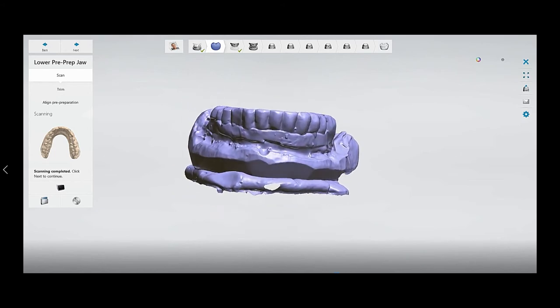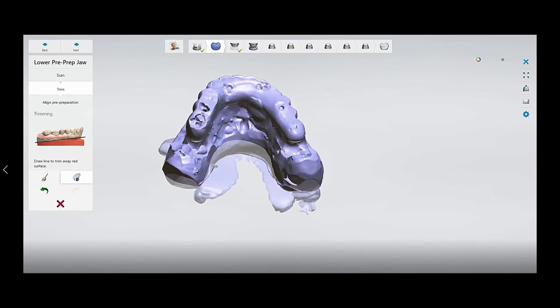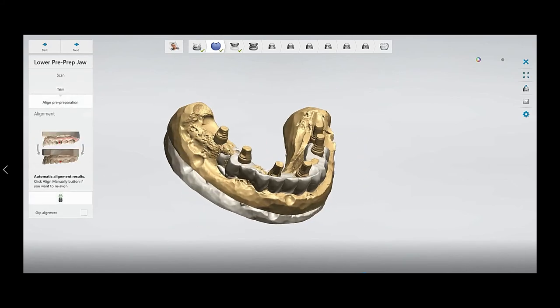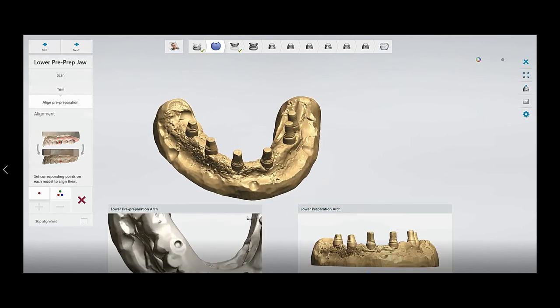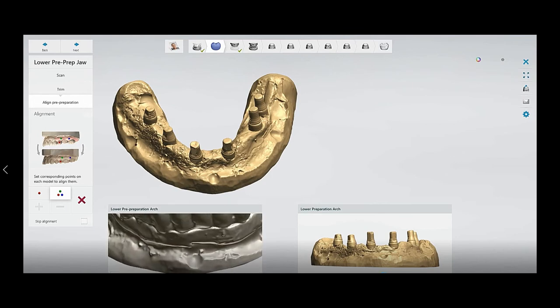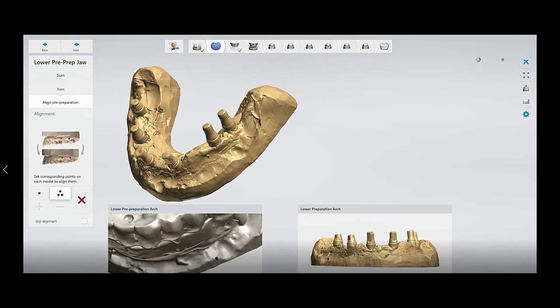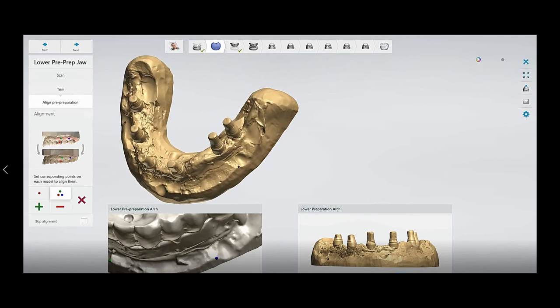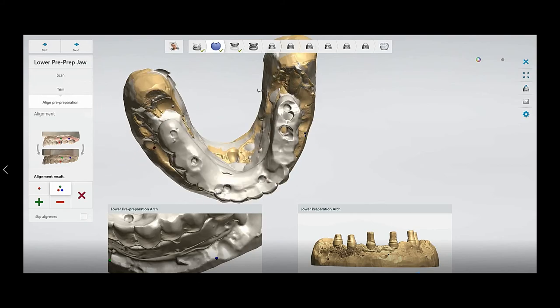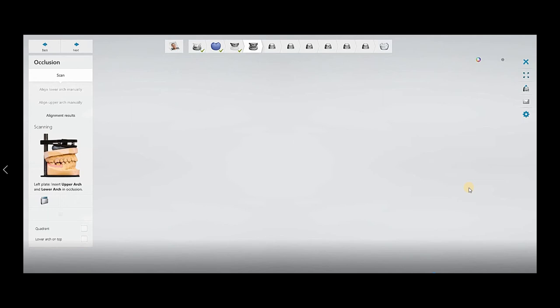After scanning the pre-op model you can trim it. After the trimming, you can align it with the prep model by selecting three or one mark on both models. Depending on how you are going to align it with the pre-op, as you can see I have three marks on both models so I can easily align them. Before you start, make marks on both models in the same area so you can align easily.